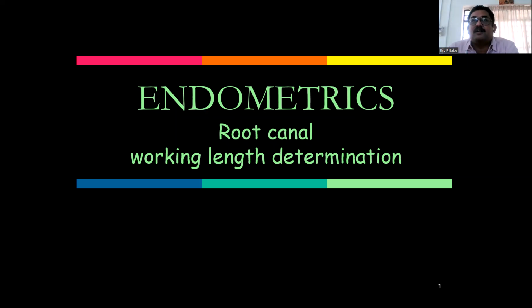When you do endodontic treatment, accurate or correct determination of the working length will give you the best results in your canal preparation and shaping and obturation. So the outcome of your treatment is always more accurate when you do a correct working length determination.